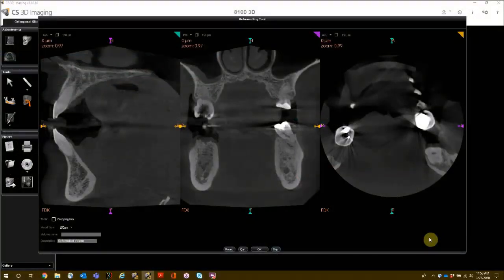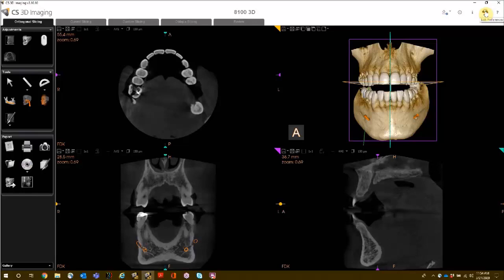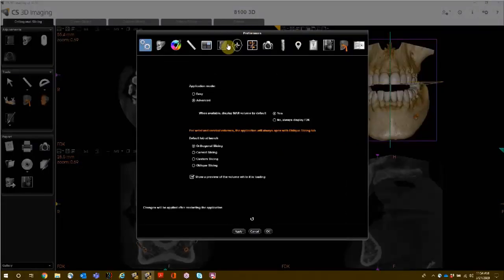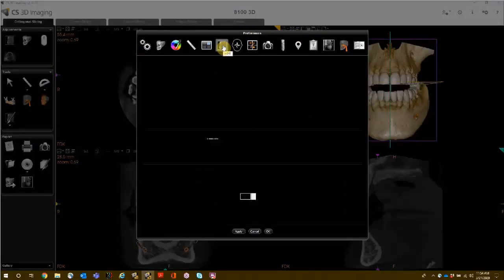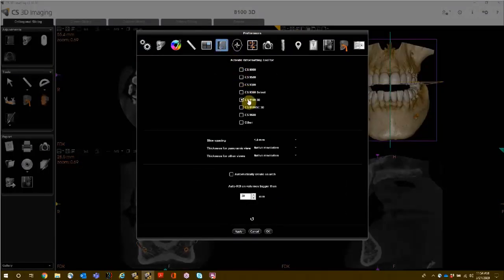Utilizing the Reformatting Tool. To use the reformatting tool, you must first activate it in Preferences. Open Preferences and select the MPR icon. Choose your Acquisition Device, then click Apply and OK.